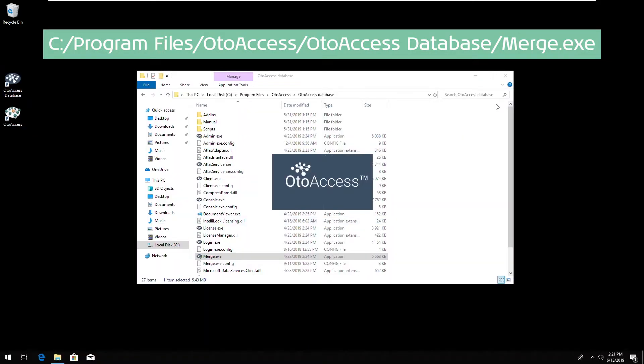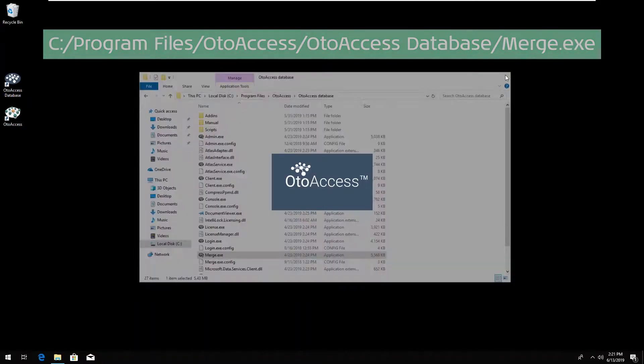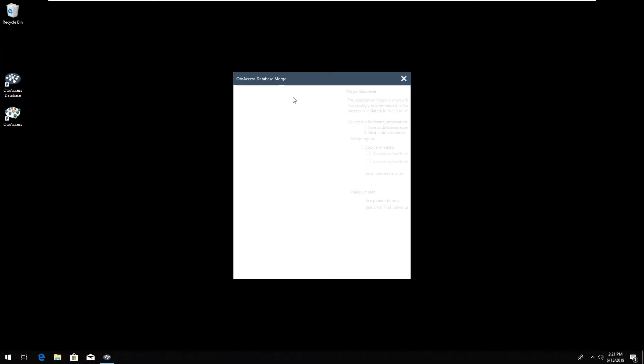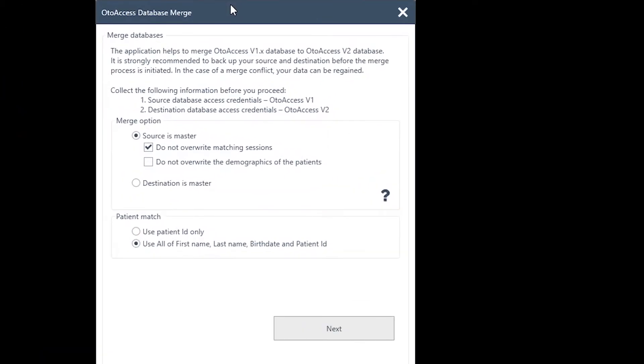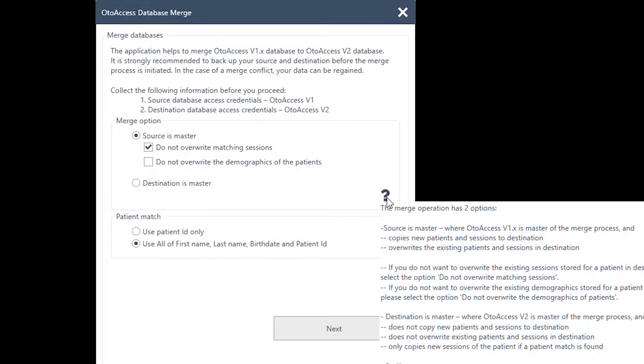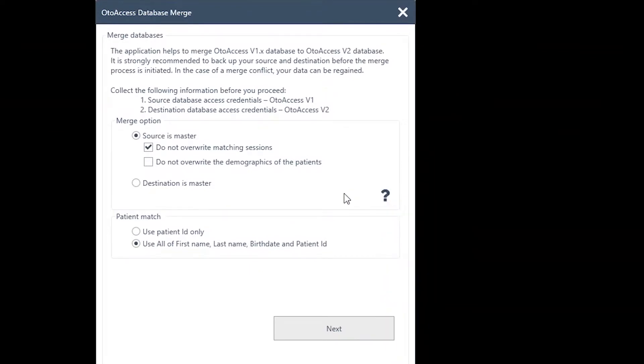Running this file, you'll have the option to choose your source and master database. You will also have different merging options available. You can read more about them and see what fits the need that you have, and you can also read more about it in the instruction for use.